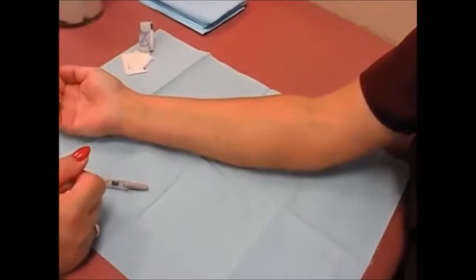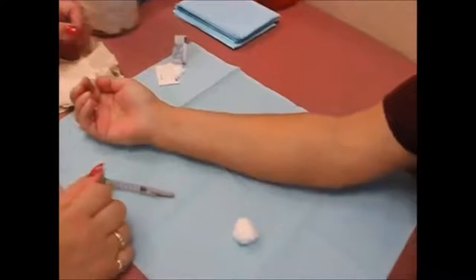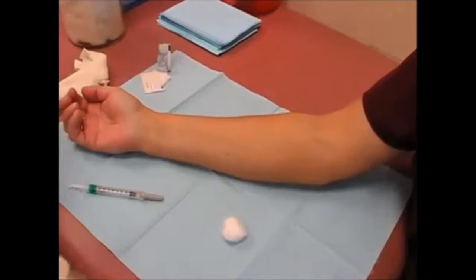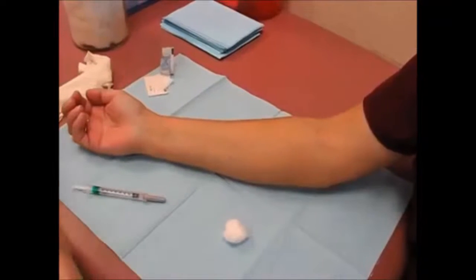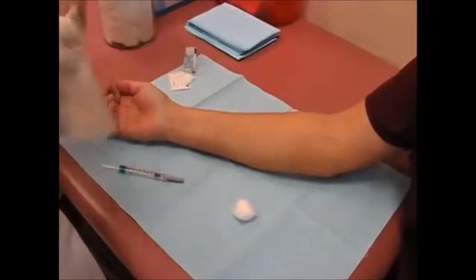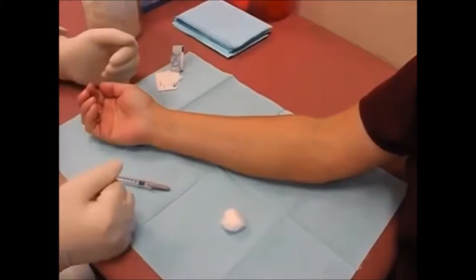For my supplies, I need a pair of gloves, my syringe, and a cotton ball. No Band-Aid is necessary for this injection. After I've wiped the site with alcohol, I'm going to apply my gloves. The reason I did the alcohol first is to give it a chance to dry during the glove application.